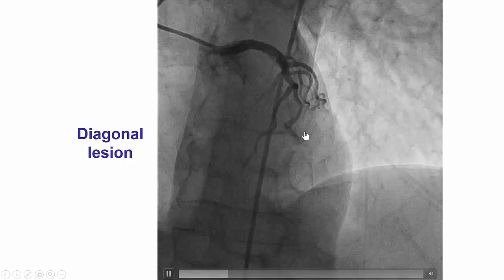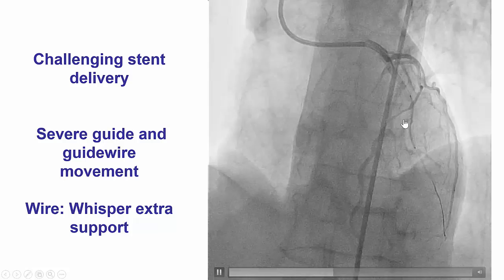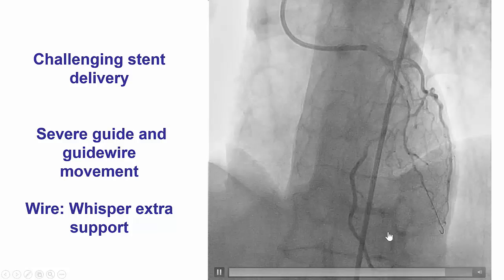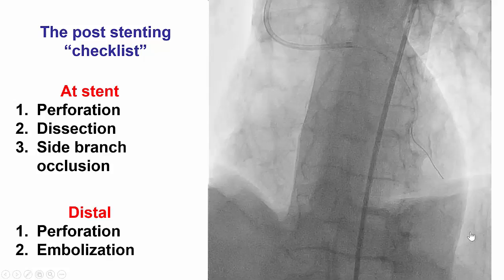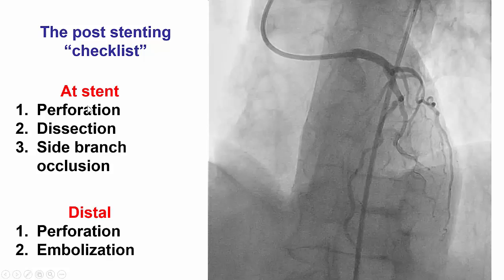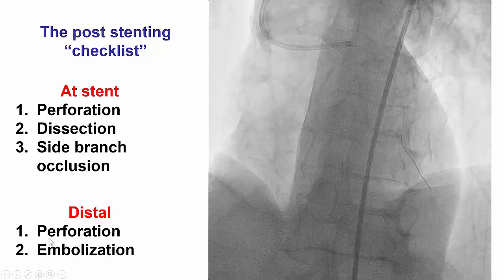This is the first case — a patient who had a significant diagonal lesion. The stent delivered to the lesion was challenging and involved severe guide and guidewire movement. The wire used was an extra support whisper wire. It is important to look at the wire movement; it is further down the vessel and with every beat seems to be coiling. The stent was placed, and after placement there are five things we should always check for, both at the site of the stent as well as distally.